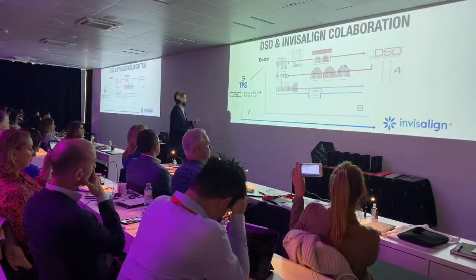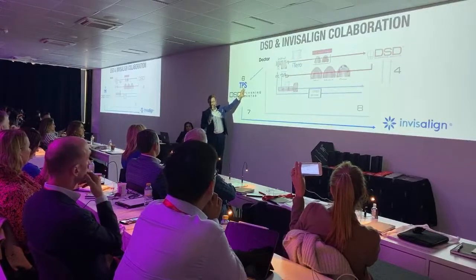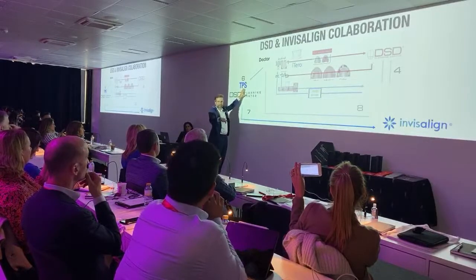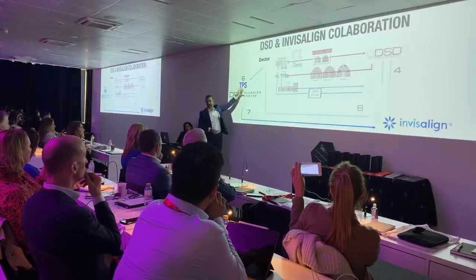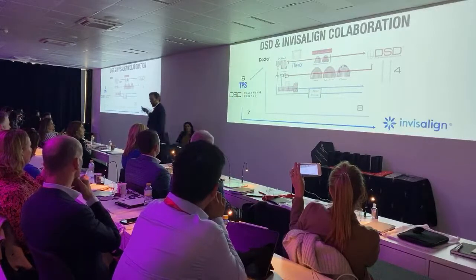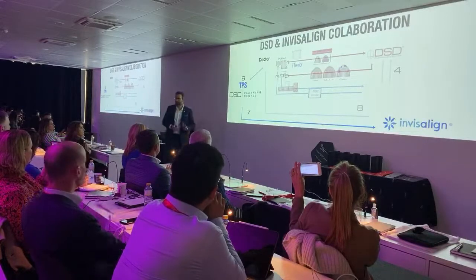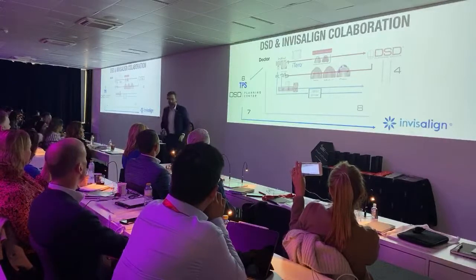But since TPS is available, I think it's much better because you're working already inside the platform that will generate the final, real ortho that will generate the aligners. Since we can have our inputs here directly, we thought it wasn't worth spending time before. So the turnaround time got shorter. It's not 5 days anymore. Before it was 5 days, now it's 3.